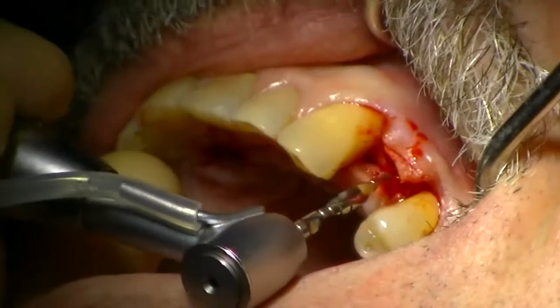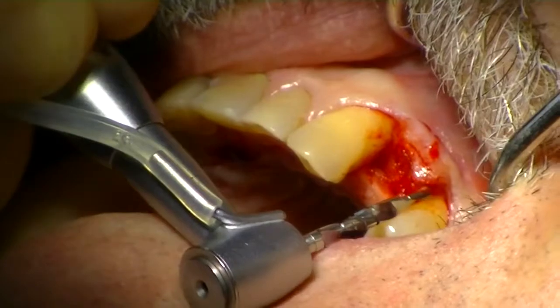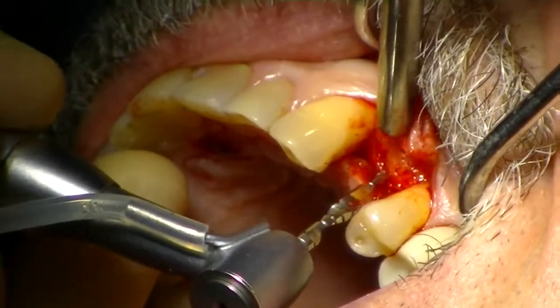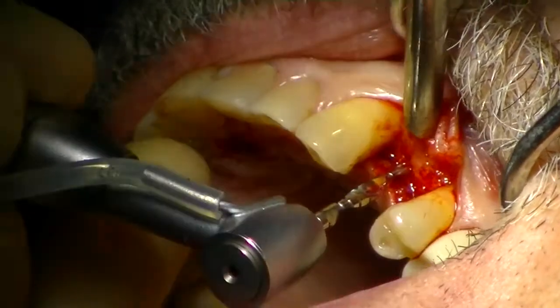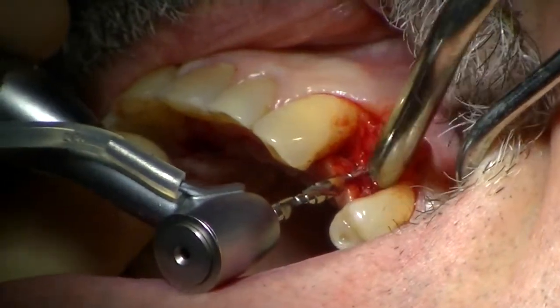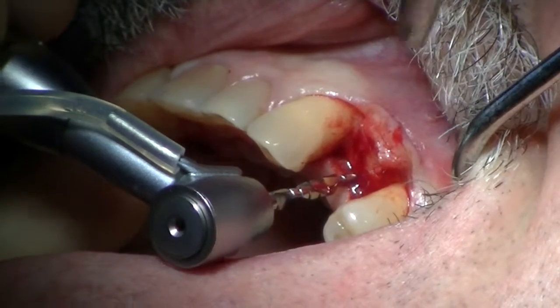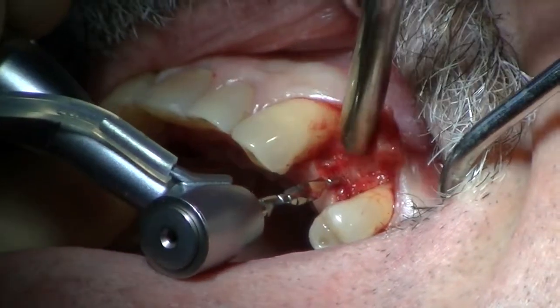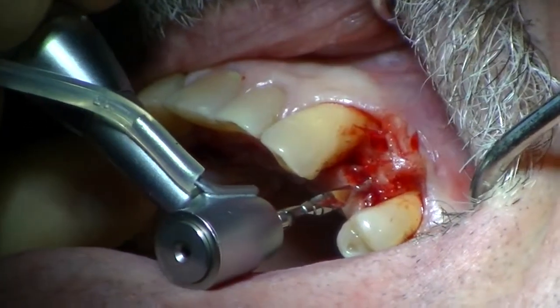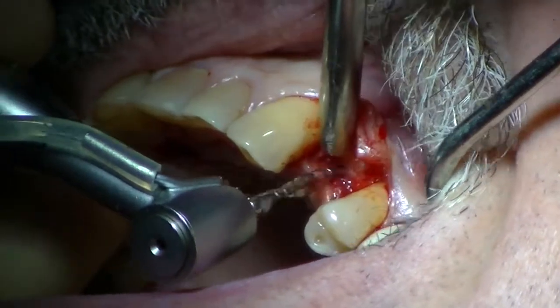So I can clearly see, if you wanted to do your field goal post, you could do that. But to expedite, I need you to open this a little bit here. I'm looking at positioning that implant along the central groove area, and I can clearly see the positioning of my implant placement.